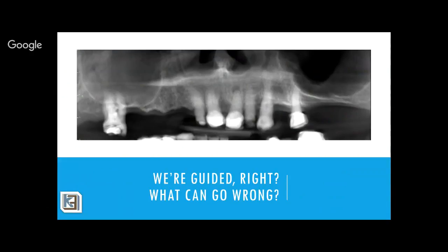And the problem is the longer the drilling path, the deeper you go in the tooth, your deflection is exaggerated and your margin for error starts to go higher. And so in your pre-planning, you have to pick the canal as high as possible to minimize the depth, and to try to minimize deflection and errors. So this is a case where it went bad on me.